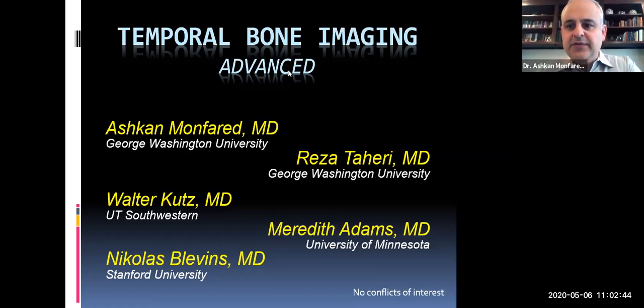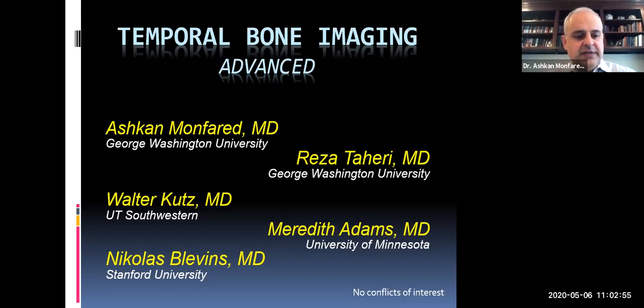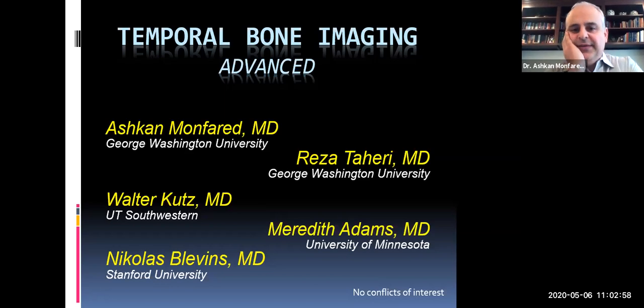All right. Good morning, everybody. Thanks for having me participate and go over these radiology slides with you. This is one of the talks that I give at the Academy every year on advanced temporal bone imaging. This is really your time, so it's meant to be an interactive talk. You can just unmute yourself at any time, and if you would like to participate and ask any questions, please go ahead and do so.